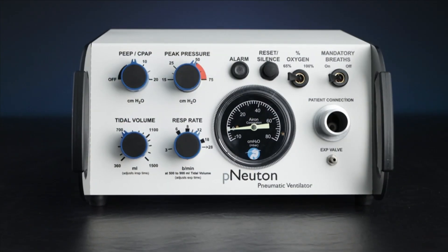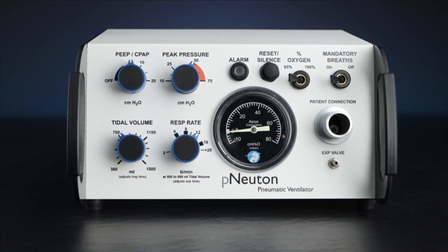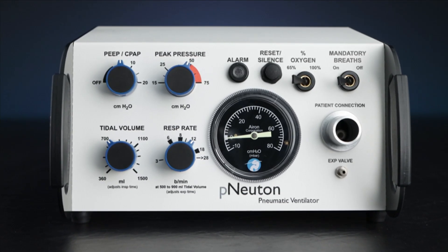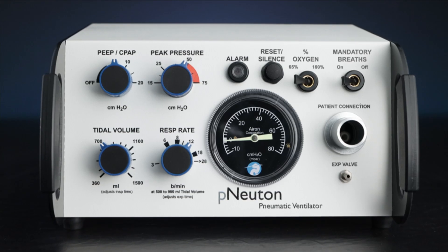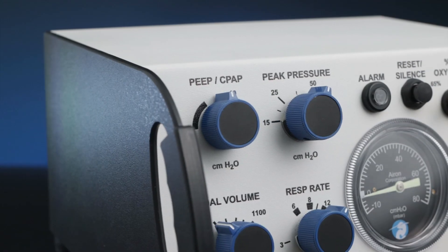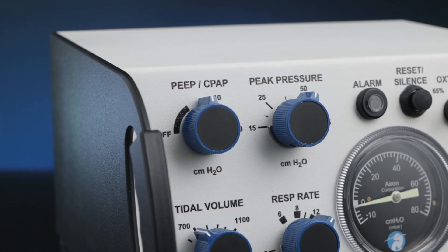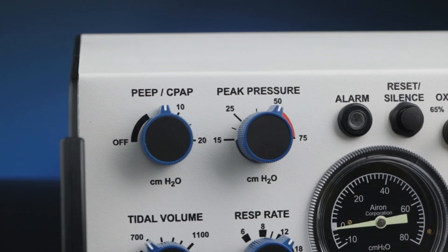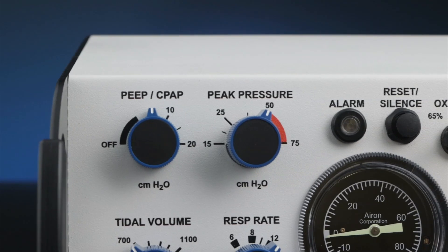It can be used anywhere in the hospital including the ER, OR, and ICU for intra-hospital patient transport and bedside ventilation support. The fact that the Model A does not require electrical connections or batteries for operation makes it ideal for EMS and intra-hospital transport by air and ground.